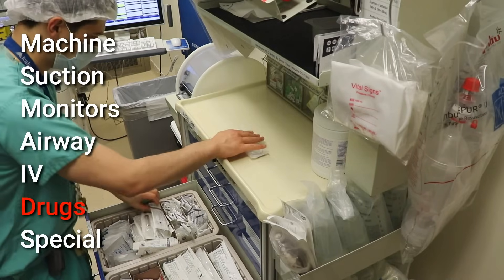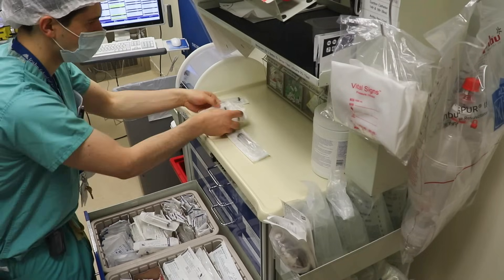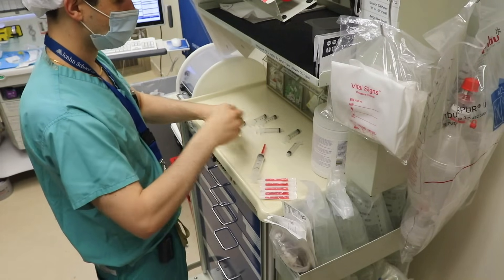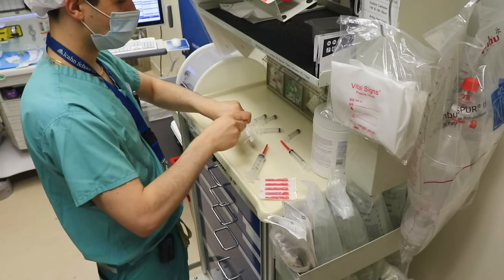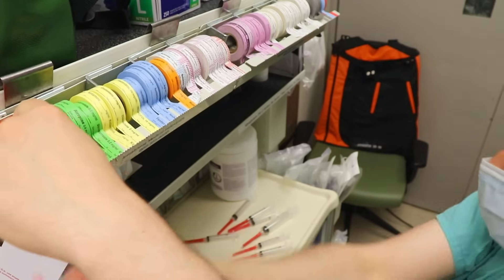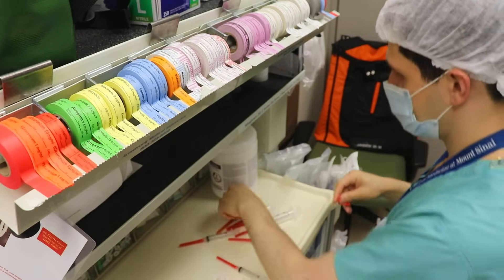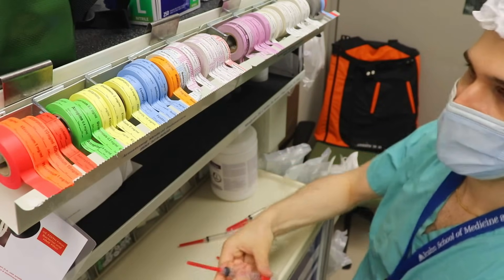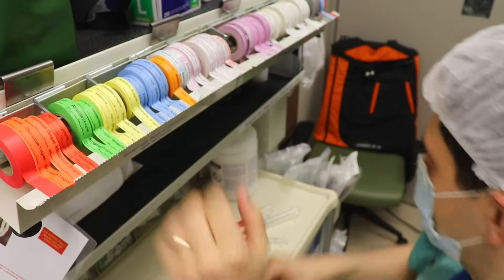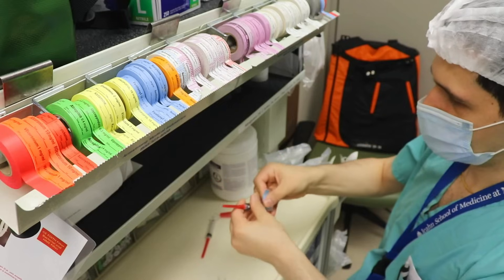Next is D for drugs, which begins with getting out all of my syringes. I've got in mind exactly what medications I want to have drawn. It's important to maintain sterility — either wearing gloves or making sure not to touch any part of the syringe or needle that will contact the patient. For today's case I want rocuronium, a non-depolarizing neuromuscular blocker; succinylcholine, a depolarizing neuromuscular blocker; reversal agents glycopyrrolate and neostigmine; propofol for induction; and fentanyl for pain control and to reduce the amount of anesthetic gas needed.